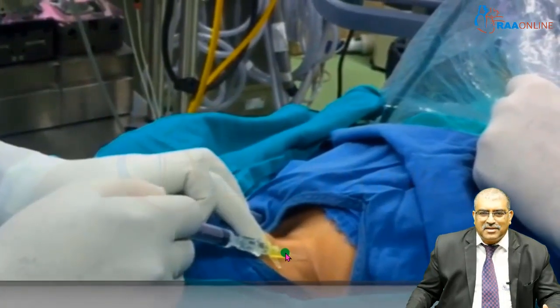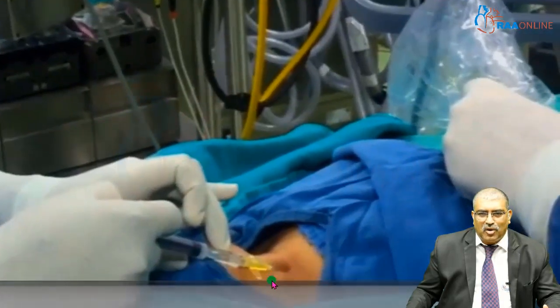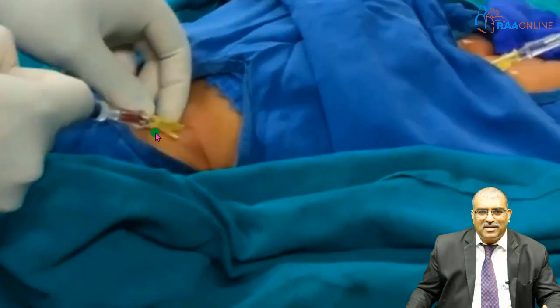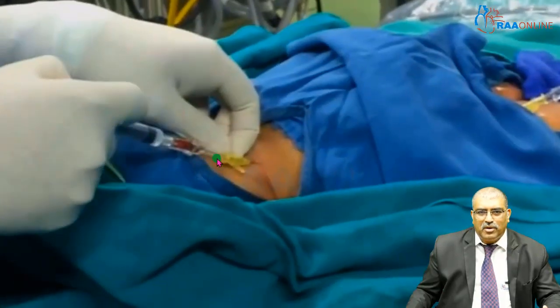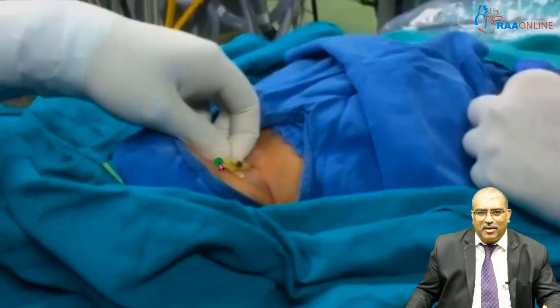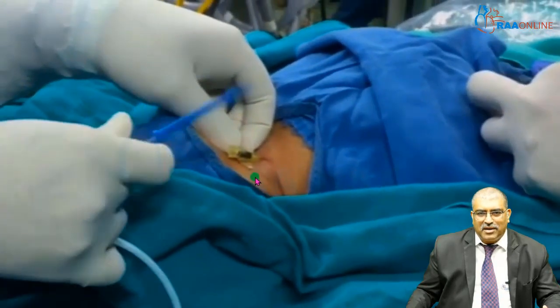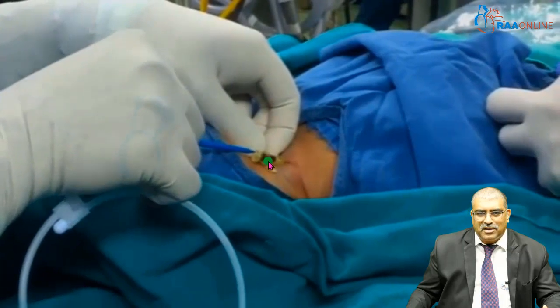Here you can see the skin being retracted, so it is taut. Now the jugular vein is being located, the needle is being removed. You can see the blood coming out. Now you will insert the guide wire inside. The guide wire is being inserted.